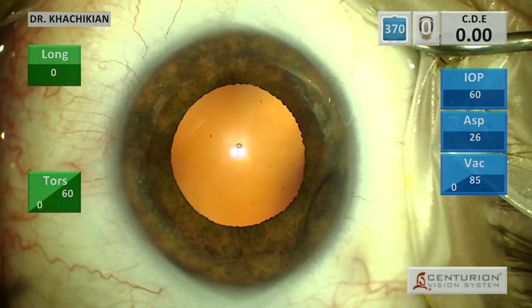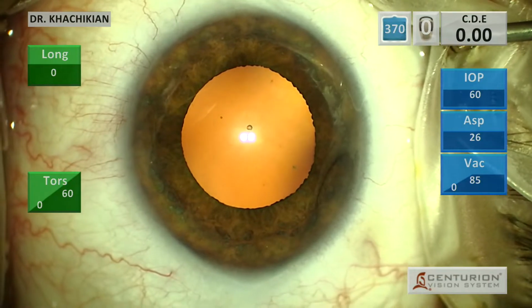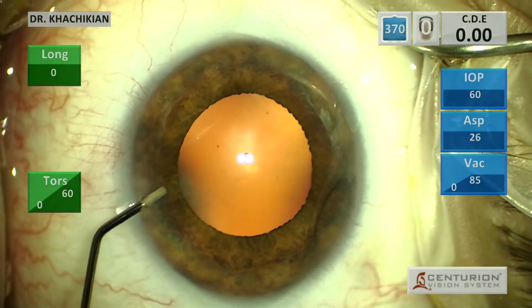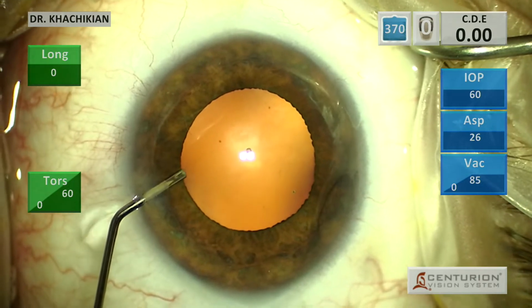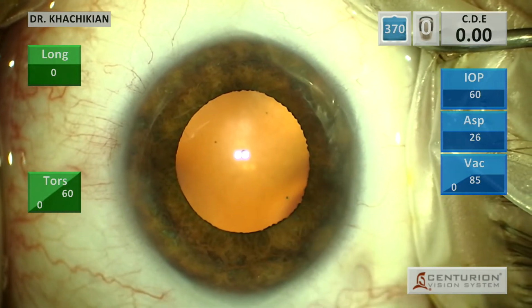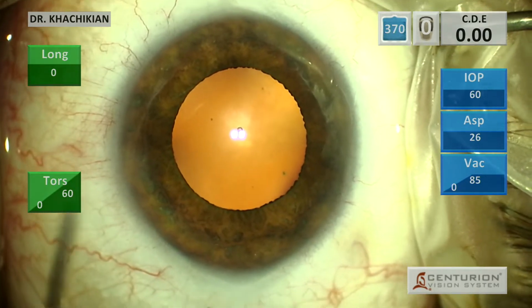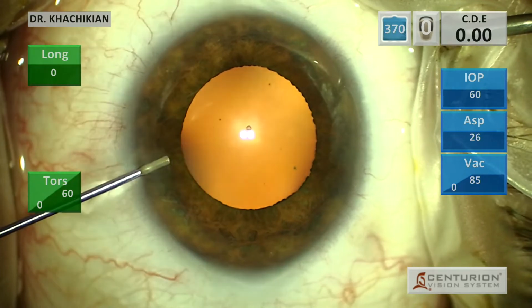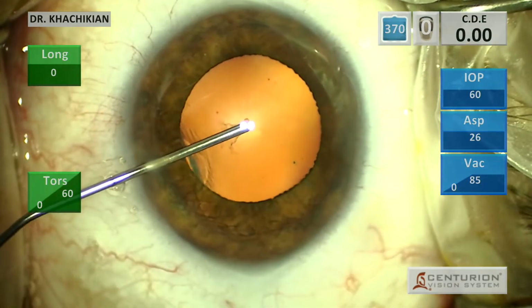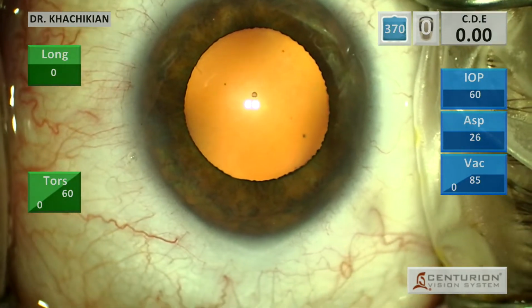We first make a side port, and I try and go in parallel to the iris with the side port slightly angled down, but sometimes the more you angle the side port, the more it tends to leak when the case is over. A little bit of BSS in the anterior chamber with Omidria to try and dilate the pupil a little bit more, and then viscoelastic. Put the viscoelastic in and just kind of one wave to get a good, complete fill of the anterior chamber.